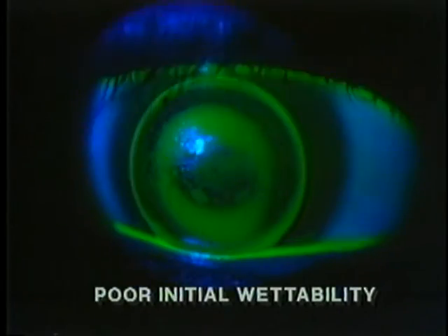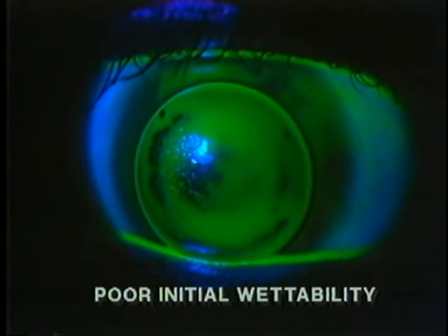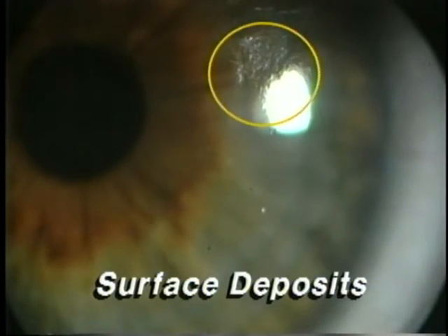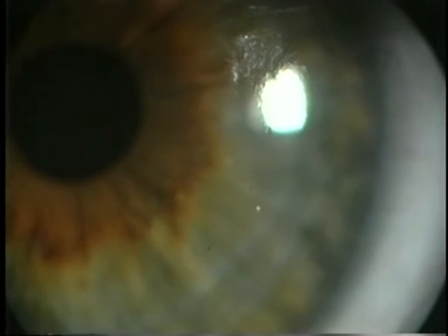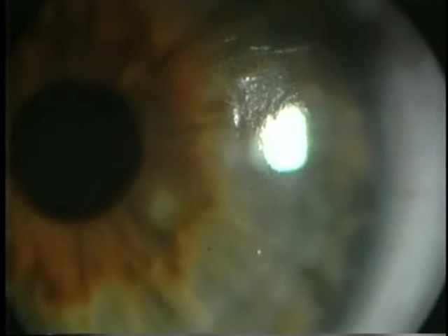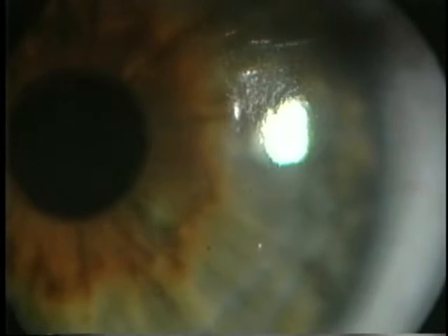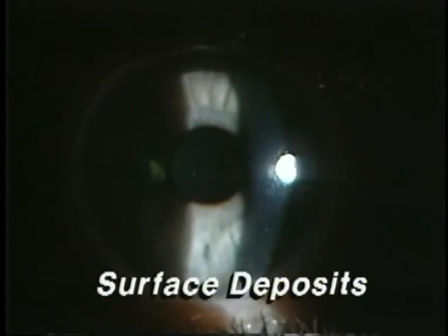Poor wettability of an RGP lens is viewed with diffuse illumination. It often results from the initial non-wettability of the lens material itself, or from residual pitch left on the surface after manufacturing. Diffuse illumination is also used to view a common soft lens problem: surface deposits. The most frequent deposit is a mucoprotein haze or film. This drying of the mucin layer on the lens surface can result in lens discoloration, blurred vision, and lid inflammation. Lipid deposits are also commonly formed on the surface of soft lenses, and a parallel piped is used to view these semi-opaque and oily deposits.